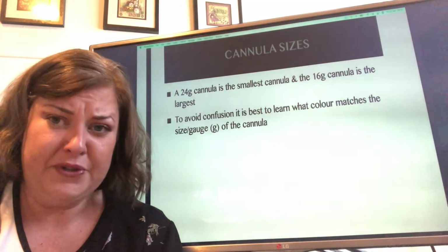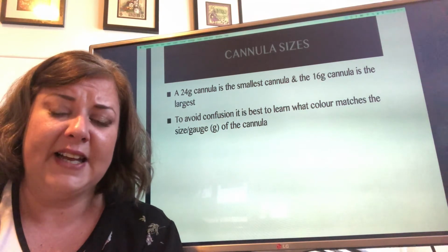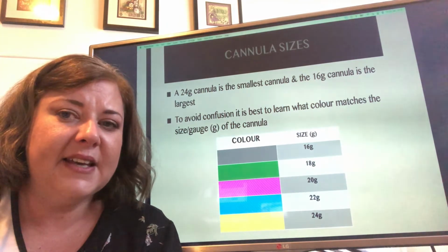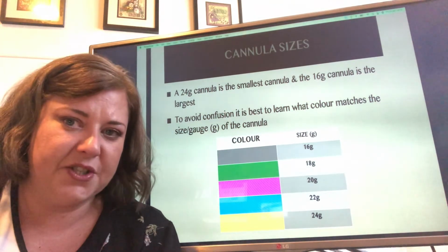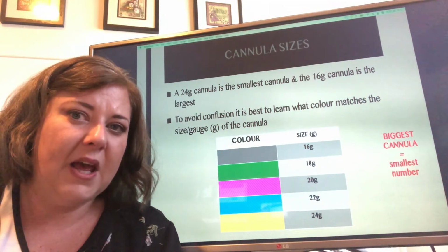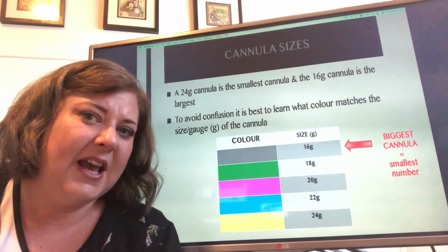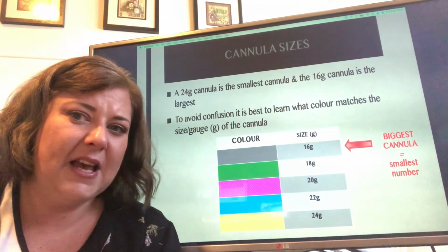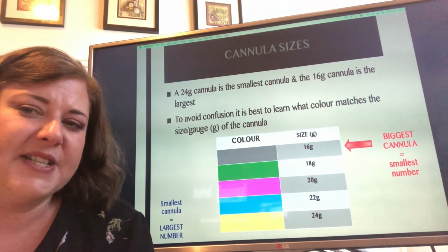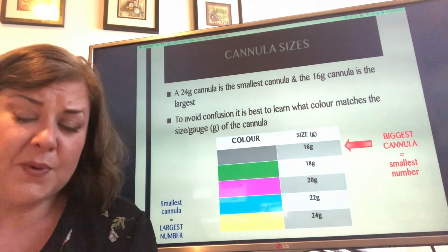To help avoid confusion with this, it's good to try and memorize the relationship between the cannula colour and its size. So a grey is a 16 gauge, all the way down to a yellow, which is a 24. So you can see that the biggest cannula here is the 16 gauge, and it has the smallest number on the list. Whereas the 24 down the bottom, which is yellow, is the smallest cannula, but it's the largest number. This is how it can be confusing.